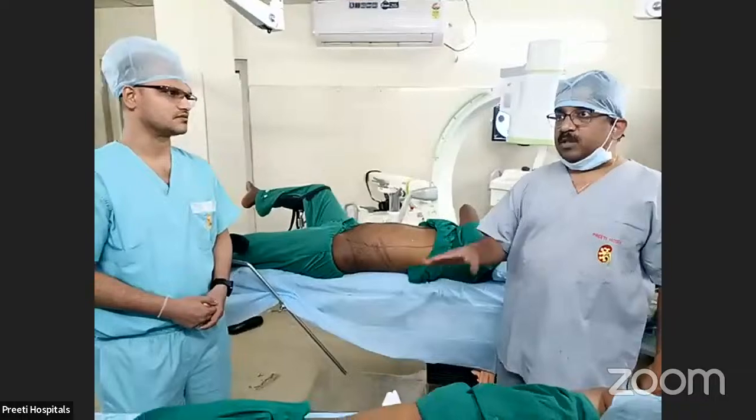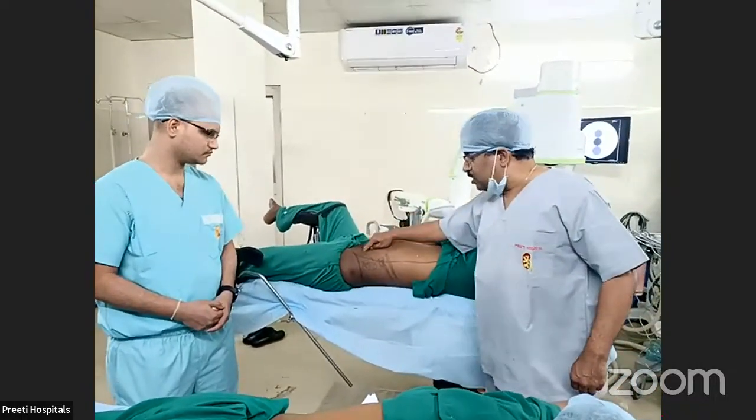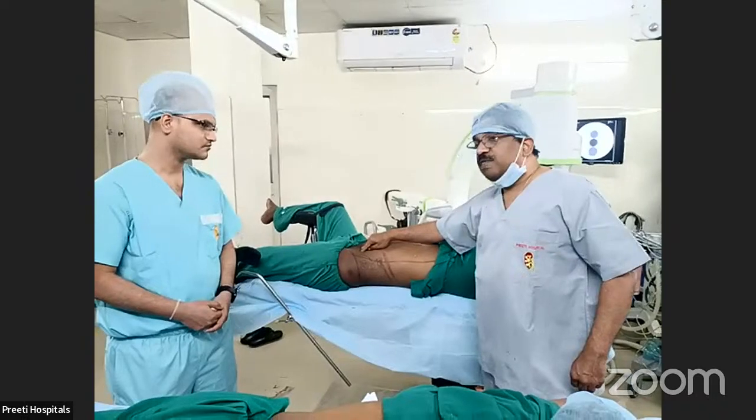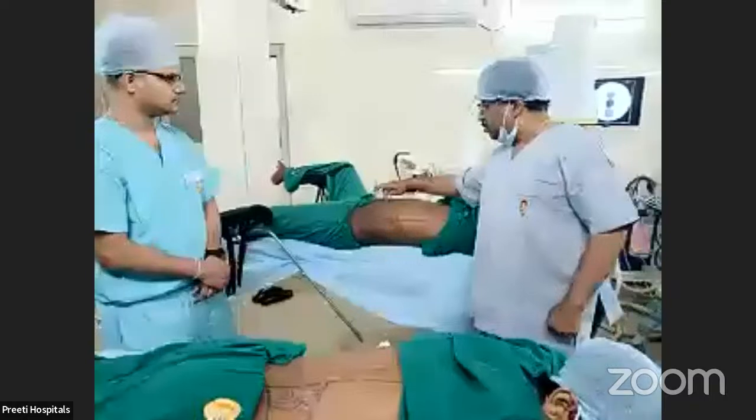You got the point. So the most medial superior calyceal stone, the most vertically directed stone, supine PCNL is not possible.